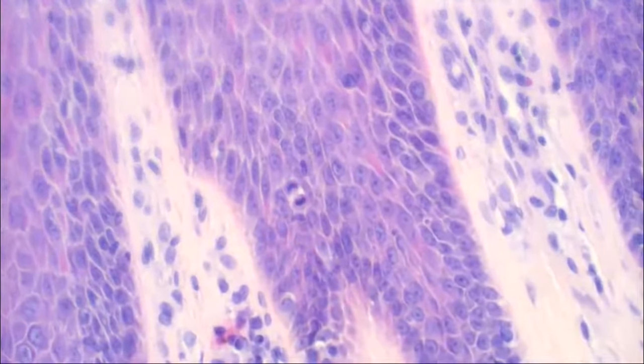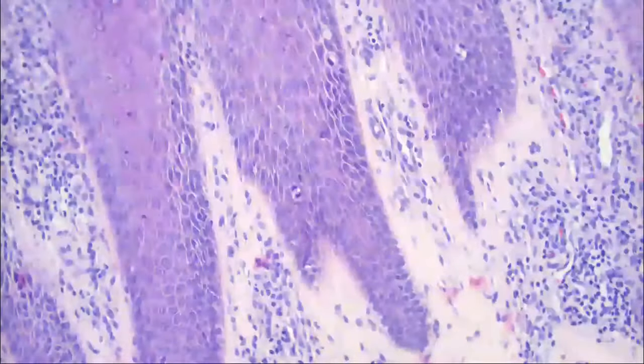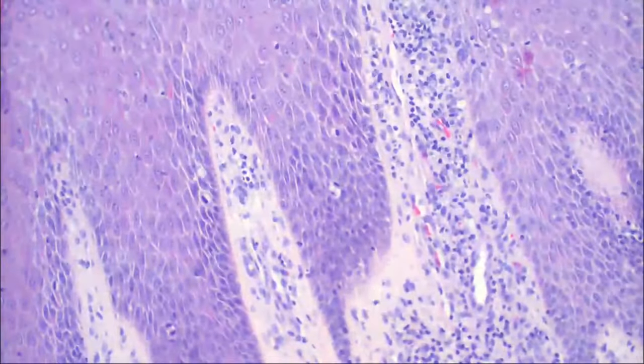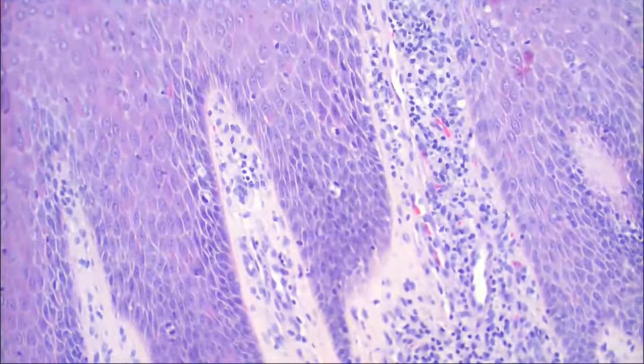So if you get maybe a partially treated lesion of psoriasis, maybe they've been on a biologic, but they still have some residual disease, and somebody wants to biopsy it, and they say, well, it won't look like classic psoriasis because it doesn't have this beautiful non-treated psoriasis morphology. And if you see suprabasilar mitoses like this, it's a clue to the diagnosis.